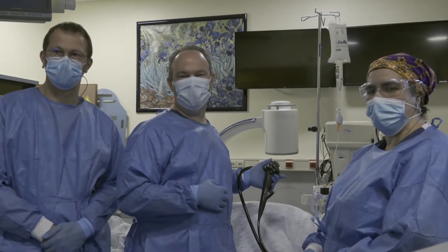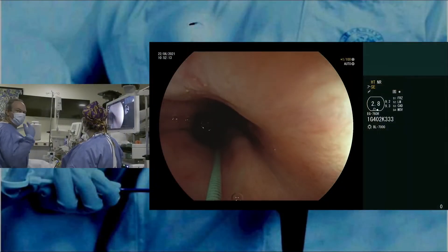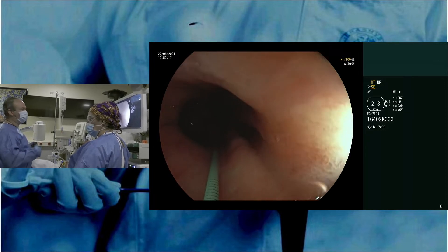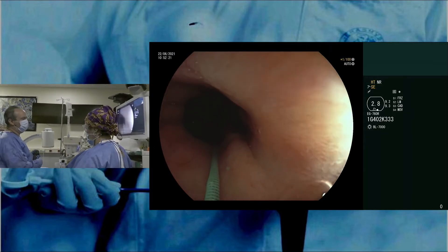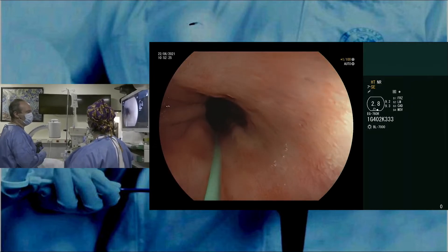Thank you very much, Ana Maria, for introducing the case. Welcome to the room. You can see we already did some preparatory work — we cleaned everything, used a mucomist or lysomucil, and we already placed a guidewire in place. The plan is to do circumferential RFA in this long-segment Barrett's.